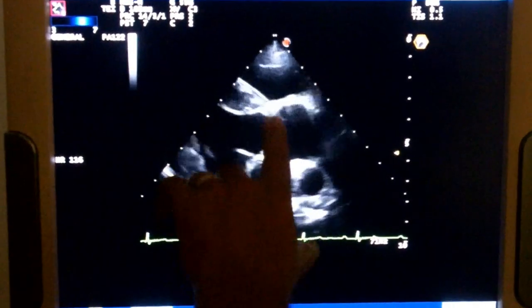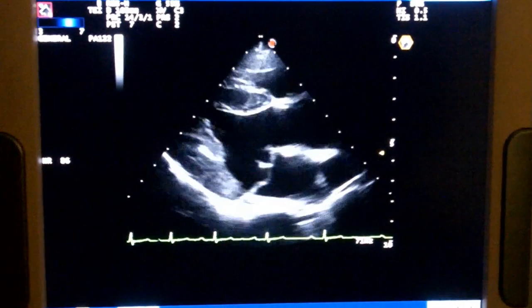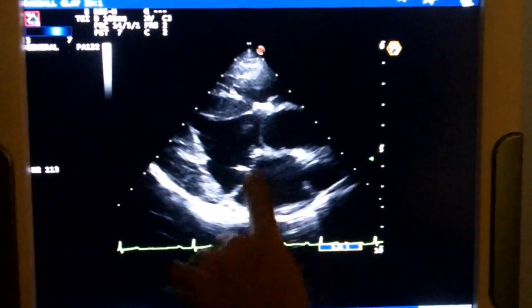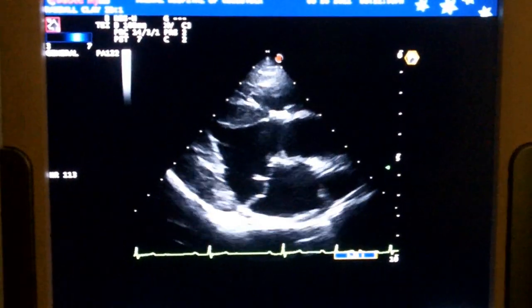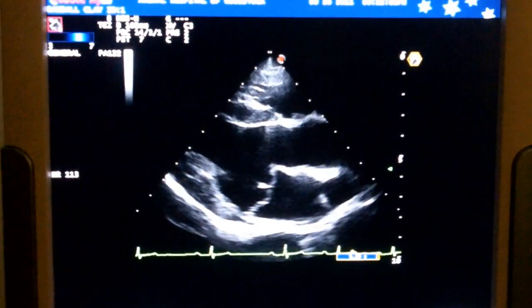We can see the aortic valve very clearly here. There is a little bit of mitral valve prolapse — we can see a little bit of outward bowing of both of those valves. It does look like it's extending a little further than the valve annula, so that would probably be classified as some prolapse of that valve.